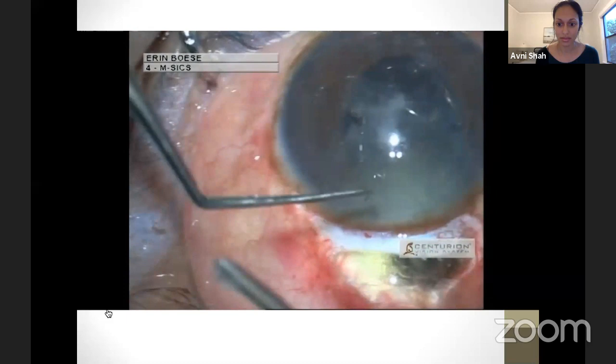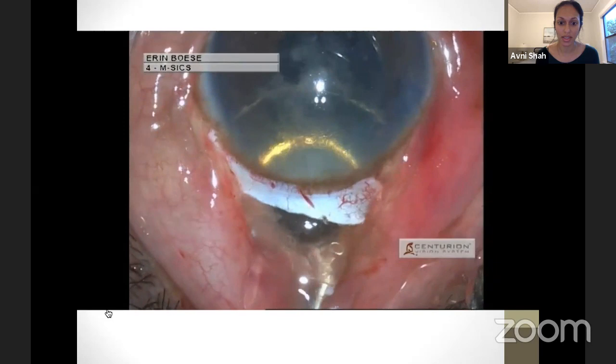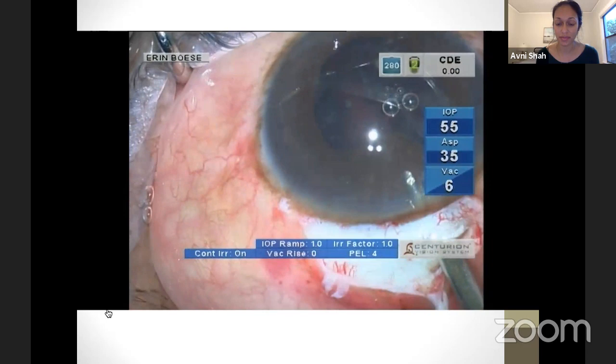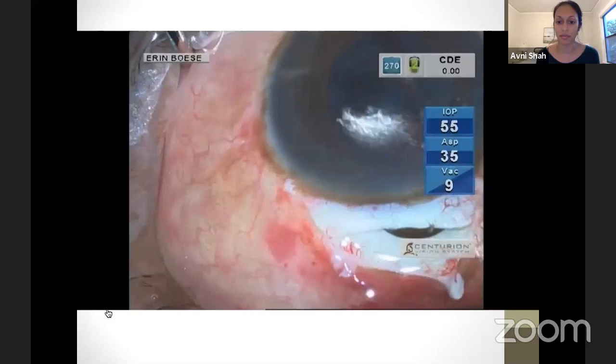Very difficult because the iris wants to come out as well. And they're trying again. The iris is trying to come out again, has to be pushed back. When you're doing IA, if you're doing it from the wound, it's very difficult. So these are all issues that you'll see if you have a premature entry, and you can see how just one issue with the tunnel makes the entire case much, much more difficult than it could have been.